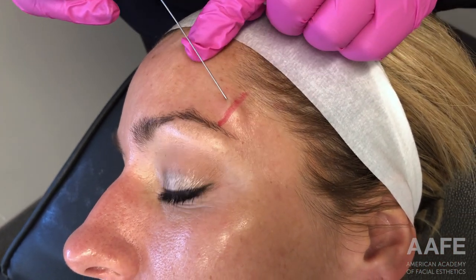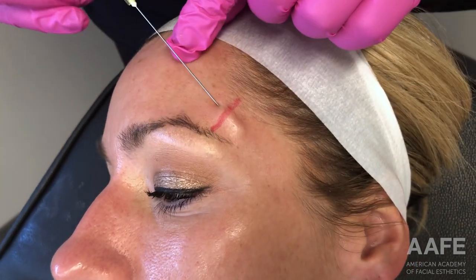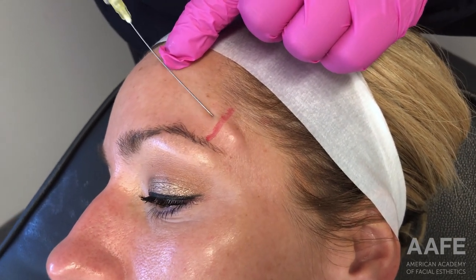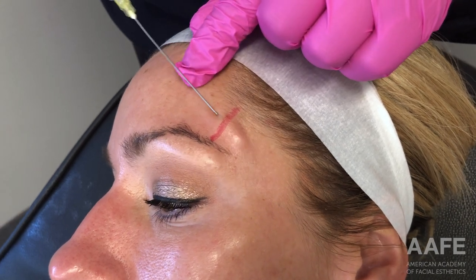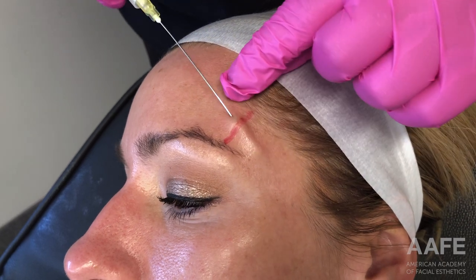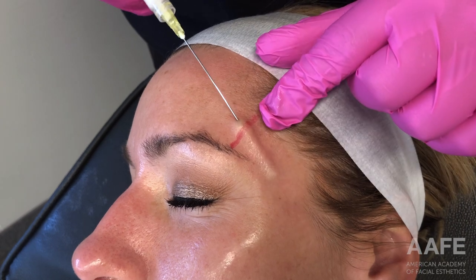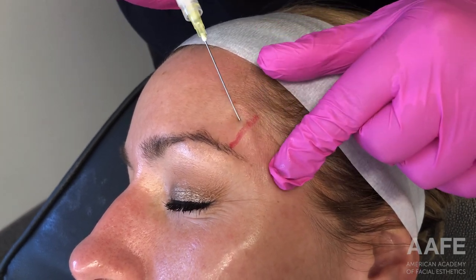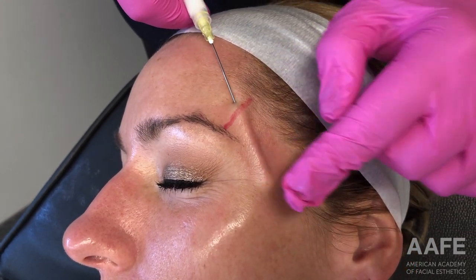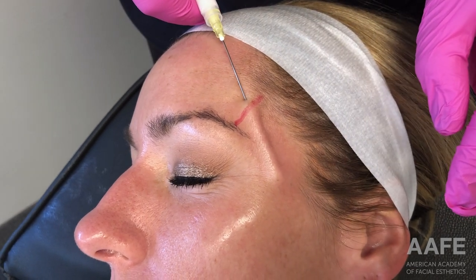We are aiming to get between the superficial and the deep temporal fascia — that is the plane we are using for the cannula. As you can see, we are just getting into that plane. This is the 75-millimeter cannula, and we are not going to enter the entire depth to the hub because it is just not necessary when filling such a small compartment. I do like the 22-gauge feature of this cannula, which is why I chose to use it.